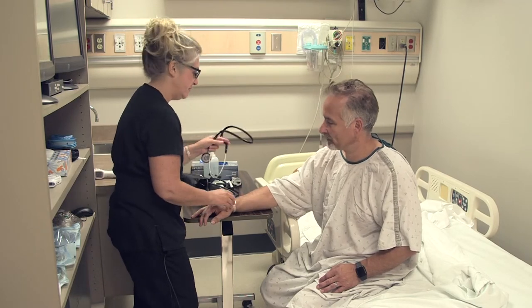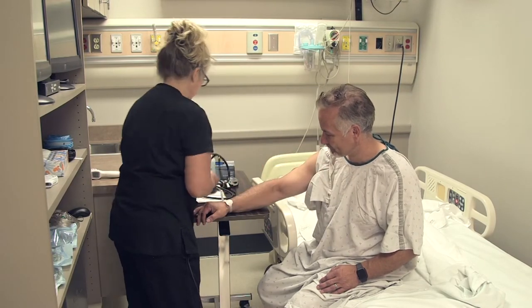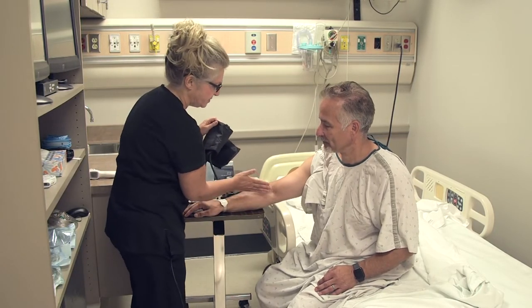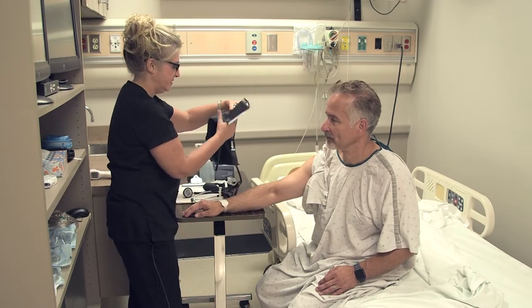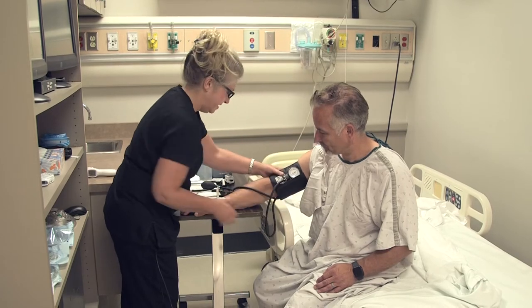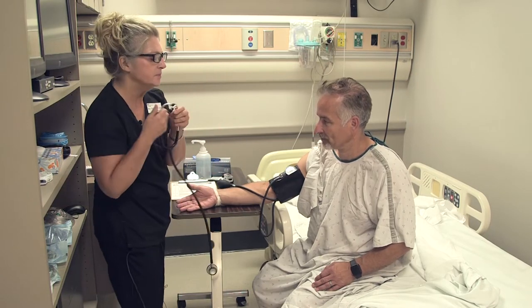Okay, do you have any preference which arm I use for your blood pressure? I'm just going to use this one if you don't have any preference. Okay, and do you know what your normal blood pressure runs? I don't. Okay, that's good. That's fine. We'll check that out. All right, just want to make sure your feet are flat on the floor there. Okay, and I just want to make sure his arm is heart level, which it looks like it. All right, so we're going to go ahead and we're just going to put this on. Okay, and then if I could just have you turn your arm just a little bit like that. Perfect.